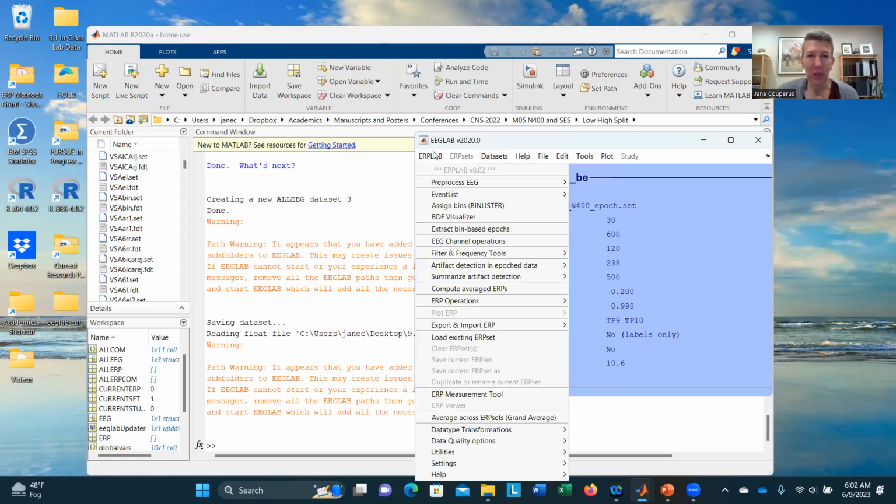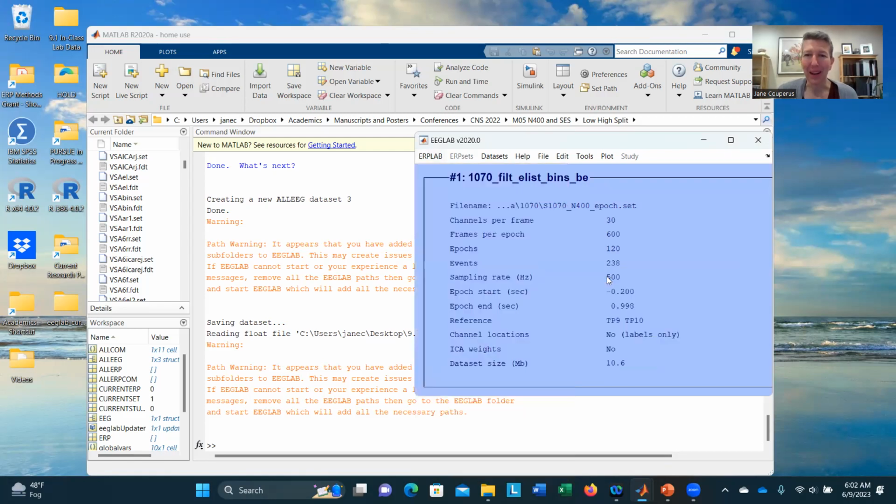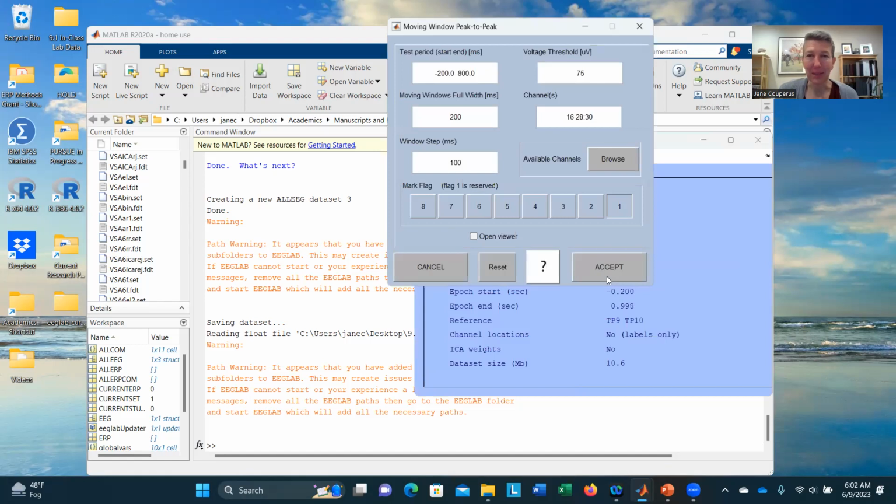So now I'm going to do another kind of artifact detection. I'm going to use moving window peak to peak. If I wanted to do both the simple voltage threshold and the moving peak to peak, I would just have used that same data set and I would have used a second flag. But I'm going back just to see the differences. So now again, I need to set a testing period. So the last time it was just the stimulus window. Now I'm going to say I'm interested in the entire epoch from -200 to 800.